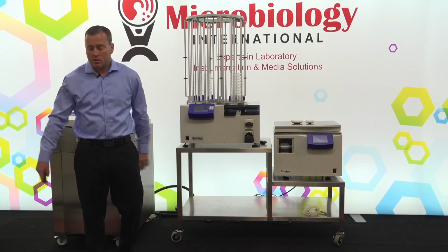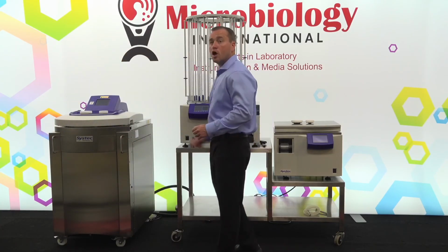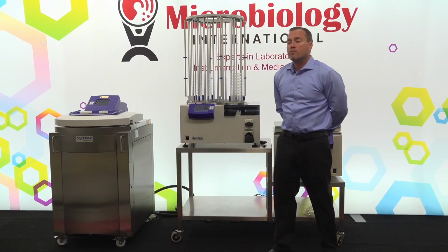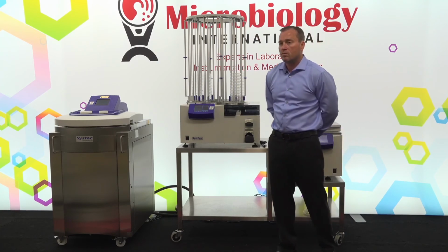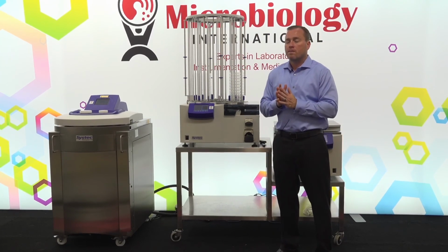Yeah, Jason, we thank you for that. We did have a few questions. So the first one would be for maintenance and stuff like that. Is there like a daily routine, and then as well as like a yearly PM service?